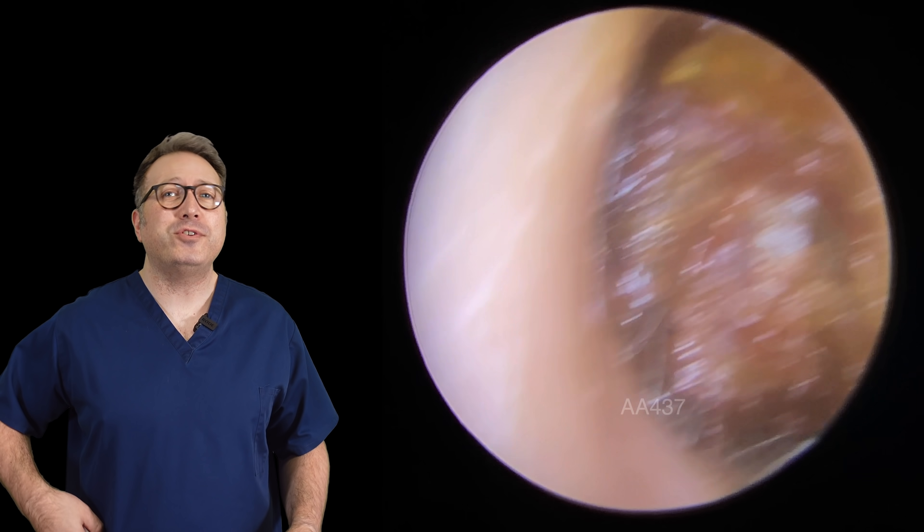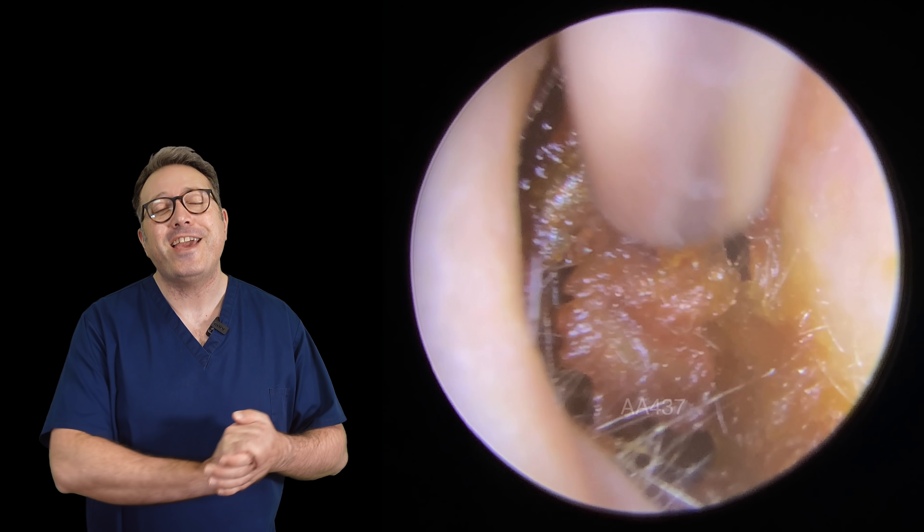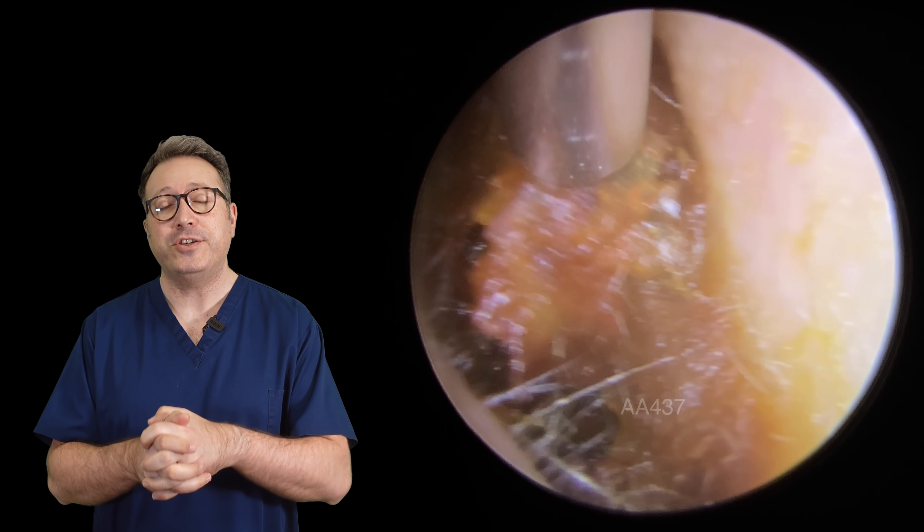Hi everybody, this is Reece Barber from Audiology Associates. Thank you very much for watching our earwax removal compilation video today. Two patients in this compilation.